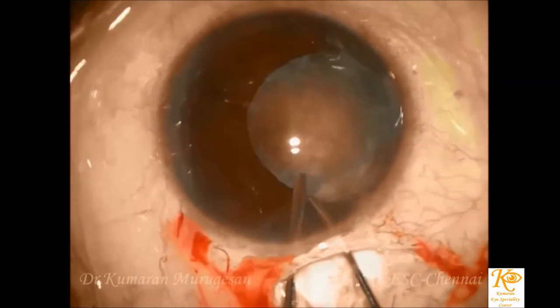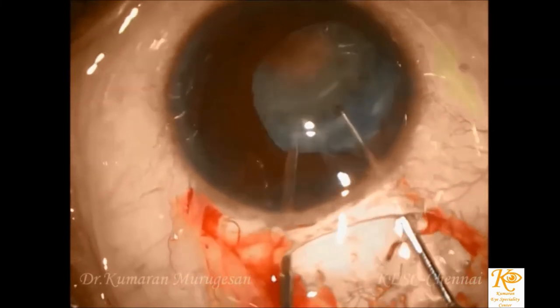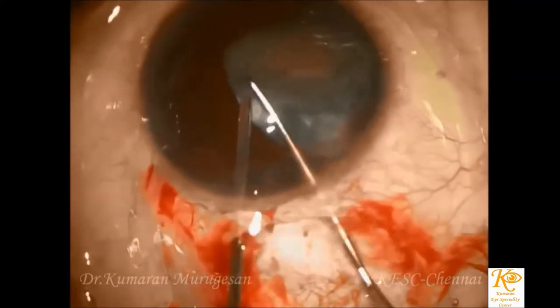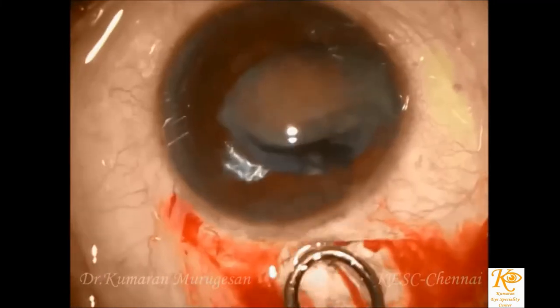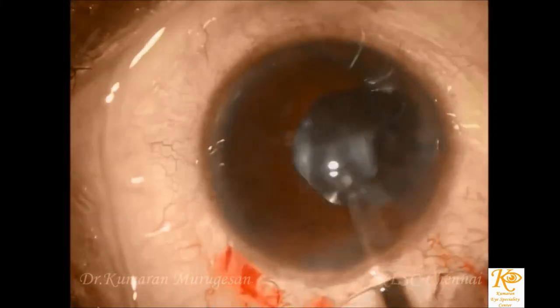Hydrodissection should be done with caution as it can lead to zonular dialysis, especially around the area of coloboma. The nucleus is then prolapsed by the bimanual technique where a cyclodialysis spatula is used to lift the edge of the nucleus while the Sinski hook is used to rotate the nucleus out of the capsular bag into the anterior chamber.